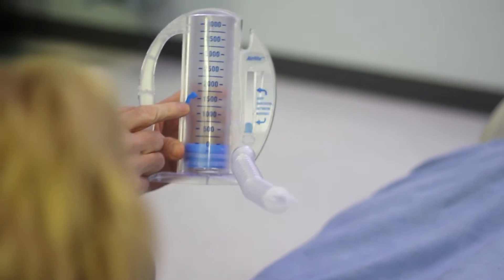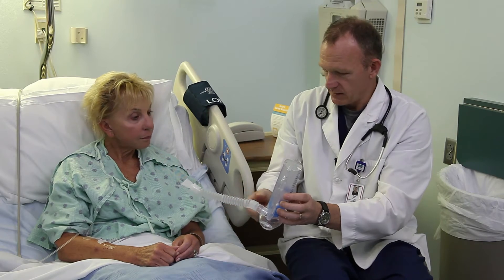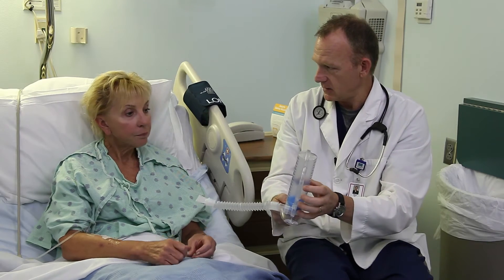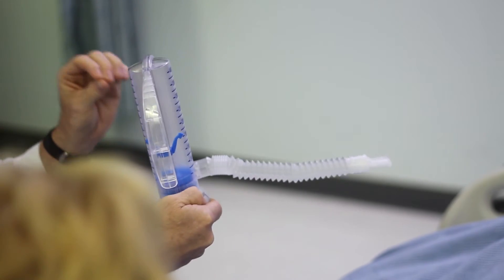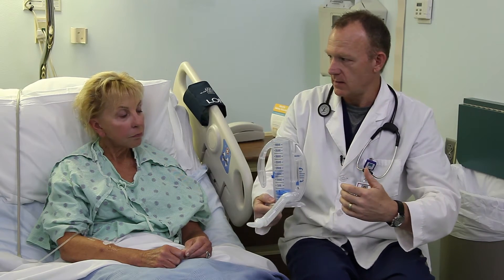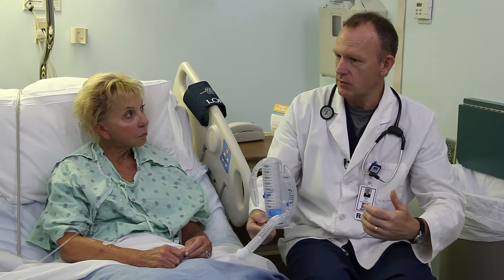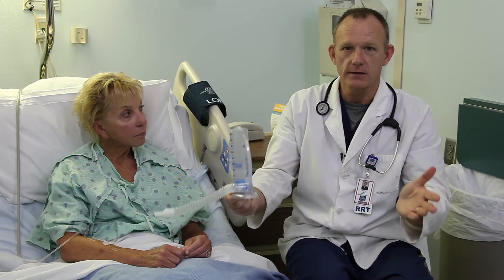What we like to do is get a goal for you, and the goal we've already looked up ahead of time. We preset it at 1,500 cc's, or 1.5 liters, and that's your inspiratory capacity. Another goal is that you breathe in hard enough — not too slow, not too hard — so that you keep your flow in between these two lines here. That helps ensure that you have an even distribution of air going into all areas of the lungs.